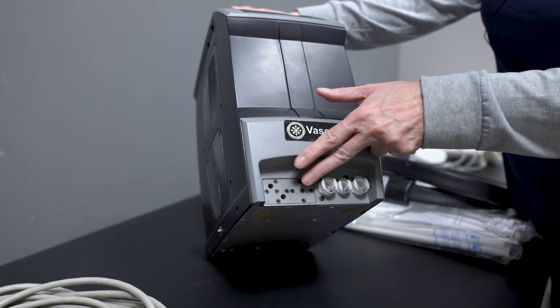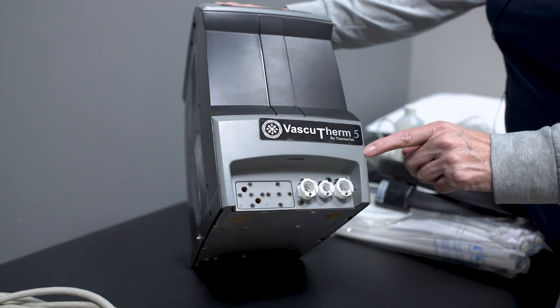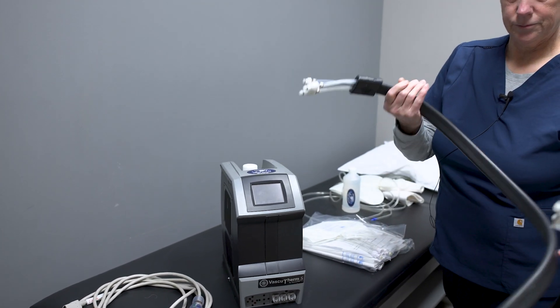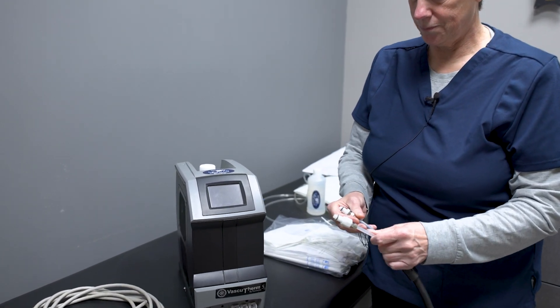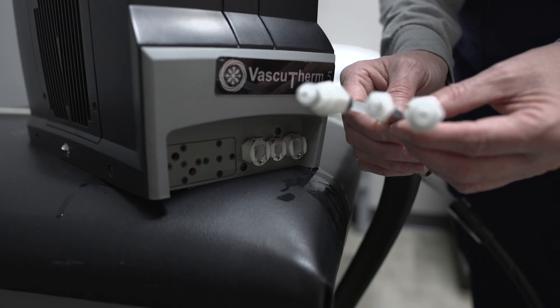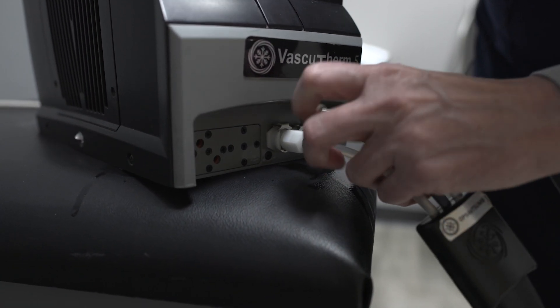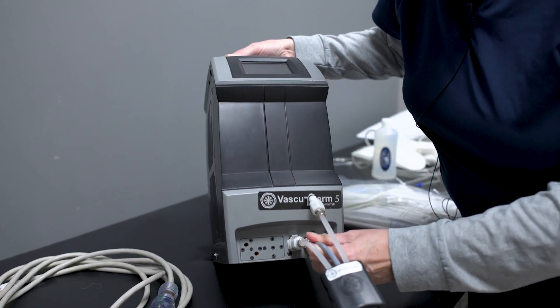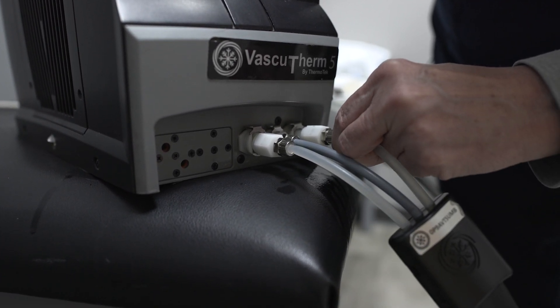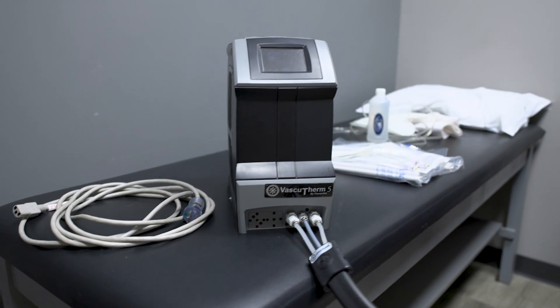We're going to be plugging in the DVT wraps here, and then we put the three hoses here connecting to that cold wrap. I always start right to left on this one. There are three hoses — two clear, one gray. I'm going to gently put them into the machine. These need to be able to snap in.